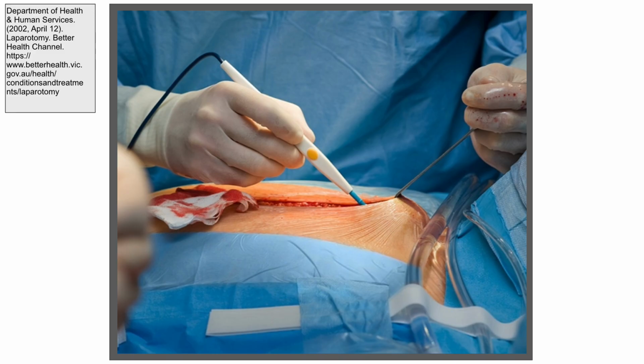Step 2. Retracting and dissecting. At the beginning of the surgery, the surgeon will use medium and big Richardson retractors to retract the area. Once the area is retracted, the surgeon will use their hands to follow the intestines to locate the problem area. They will use a combination of pickups and cautery to dissect through the tissue as necessary.